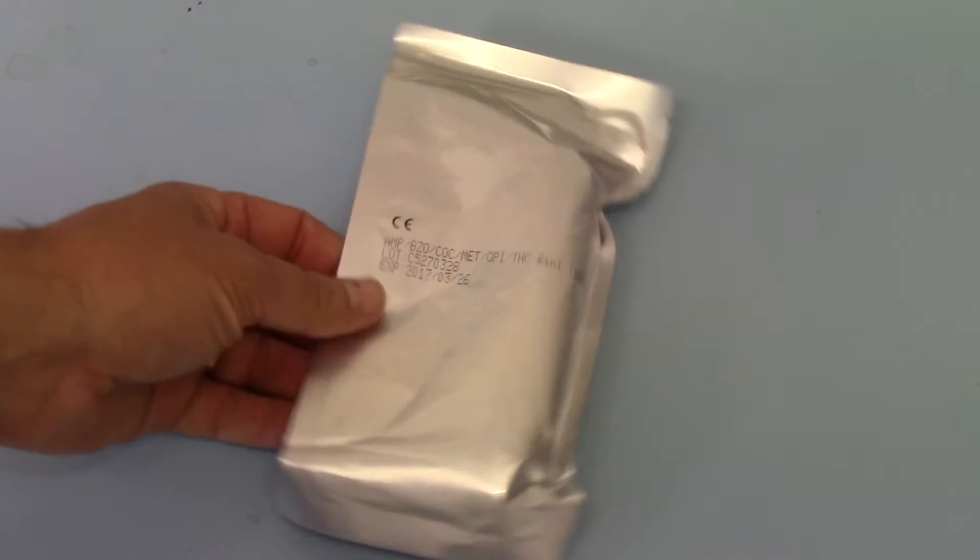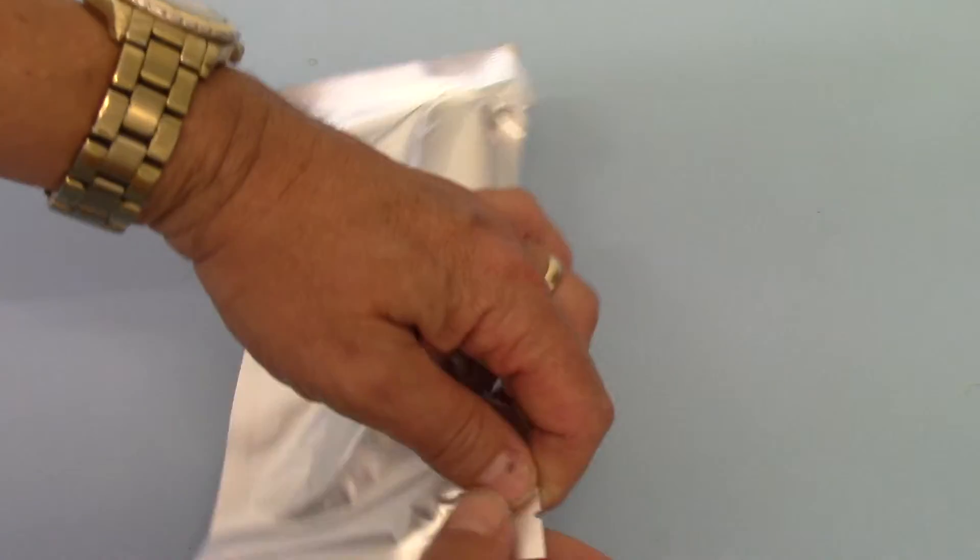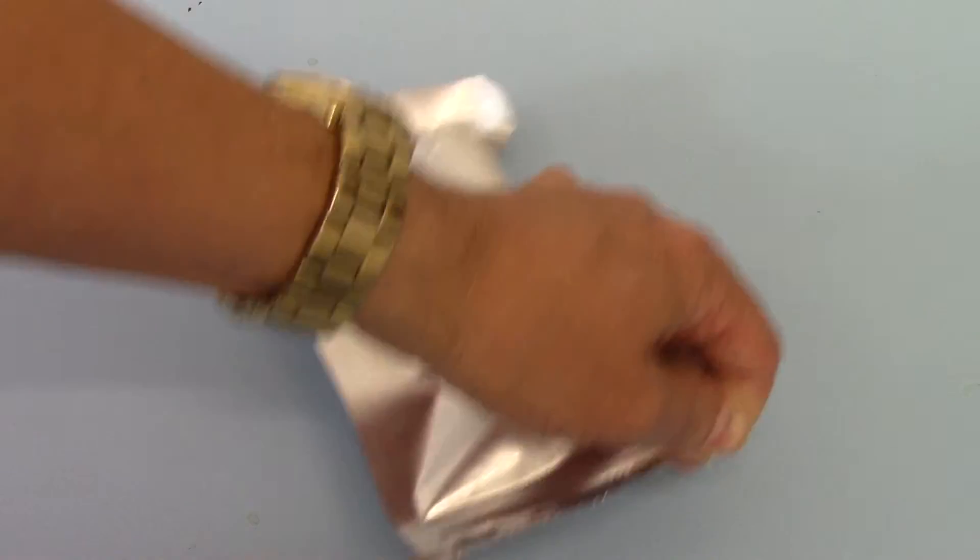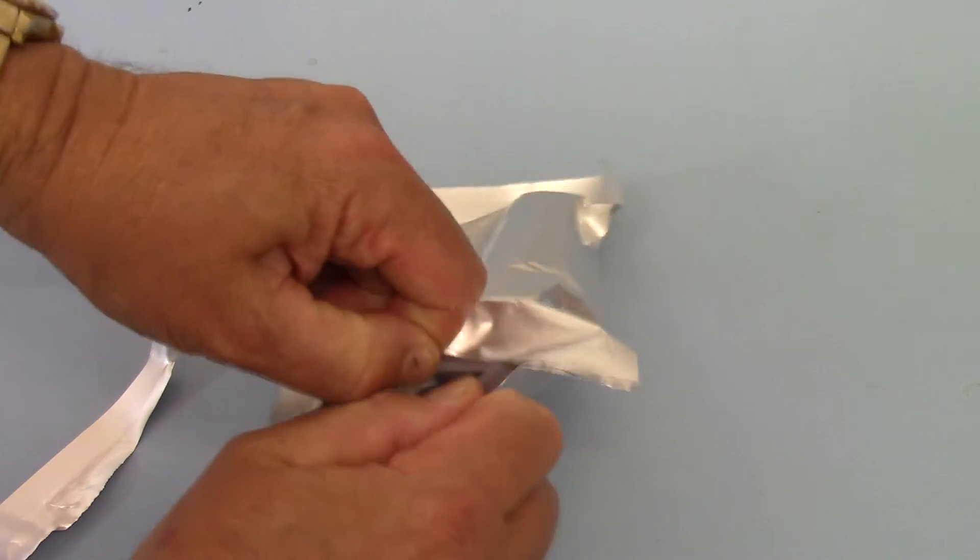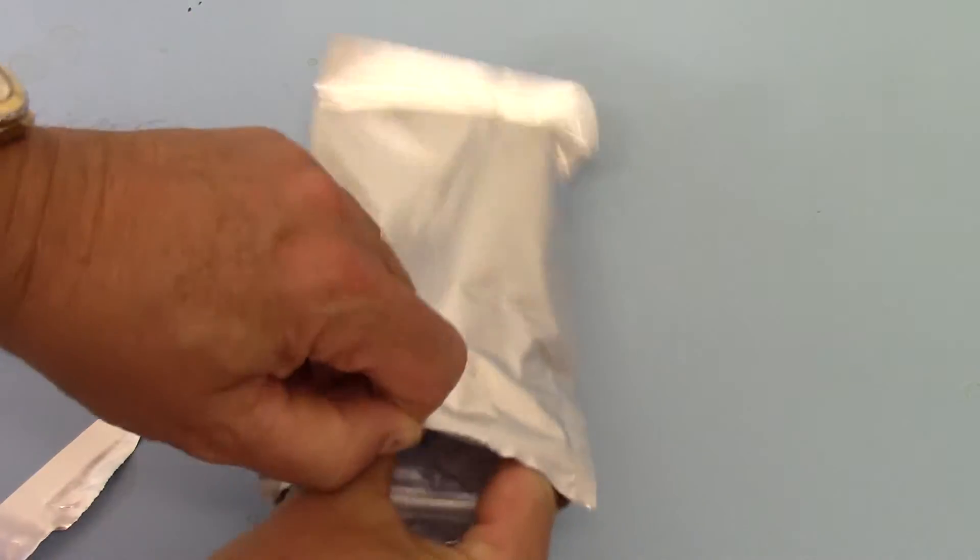This is the packaging we've demonstrated to you in part one and we're going to open one of these now just to demonstrate what you actually get. The foil tears open and then you've got a resealable pouch.